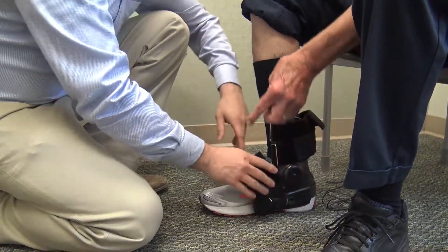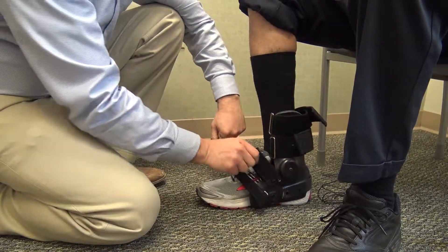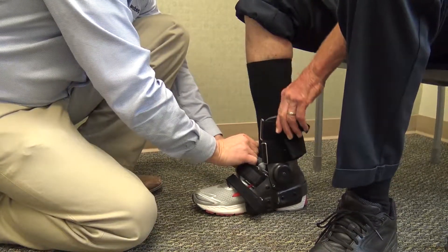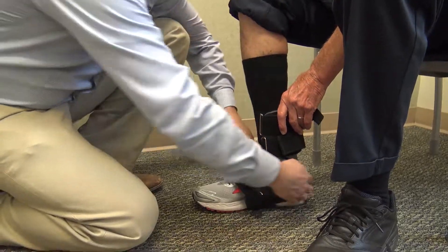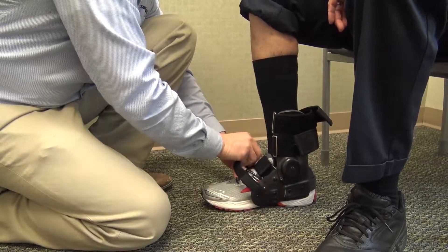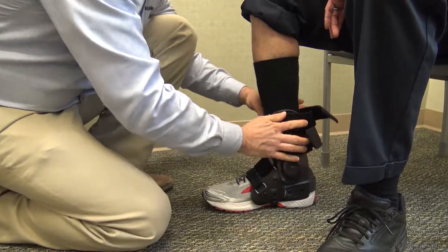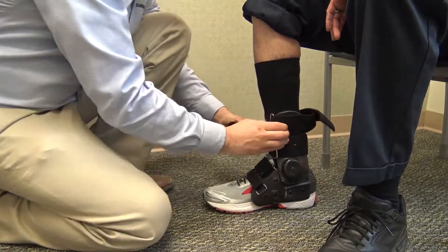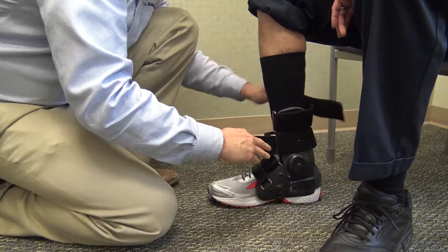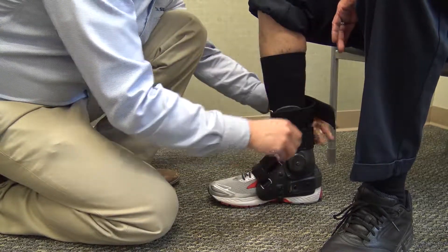And then there's a progression of straps: one, two, three, four. You always do the one right over the ankle first. You don't have to overtighten it. Notice how he pushed back there again — that's one, two, three, four.